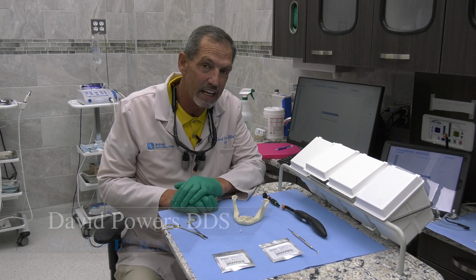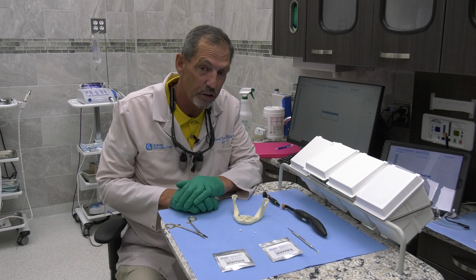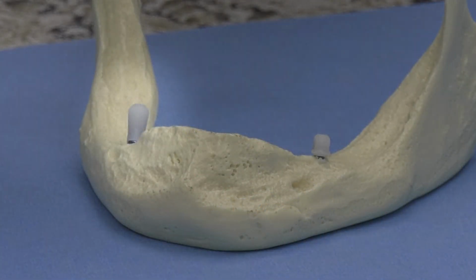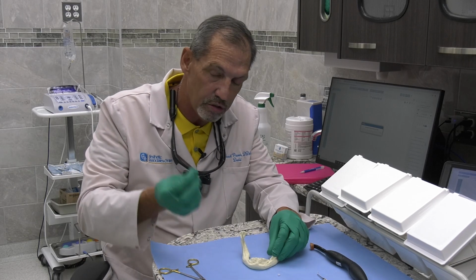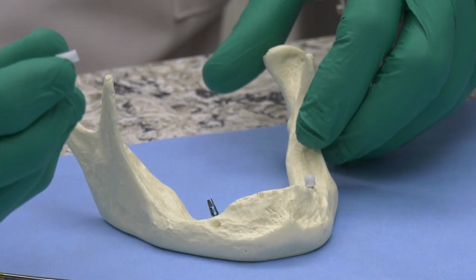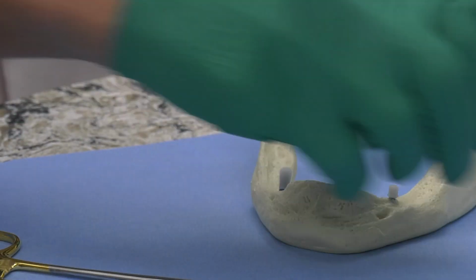Today I'm going to show you guys how to use the healing caps when we're temporizing on mini dental implants and on the new mono implants. We have two different size healing caps, one for the mono, one for the traditional MDL. In both cases, you'll take the healing cap and snap it onto the implant. They're both custom fit for the MDL and the mono implants.